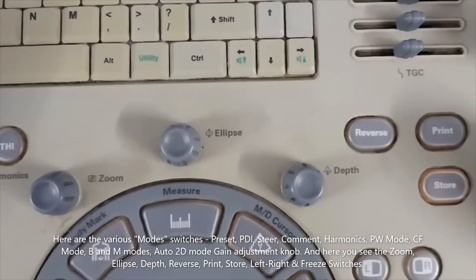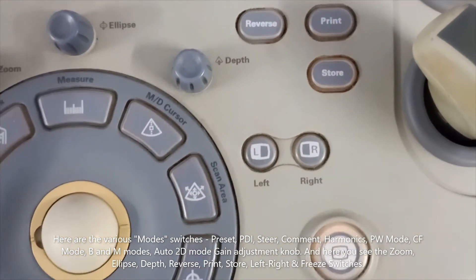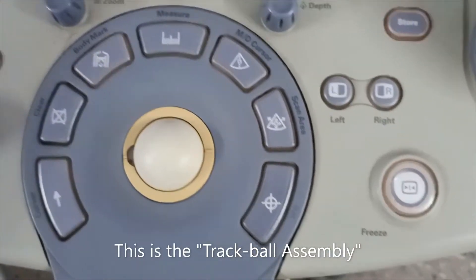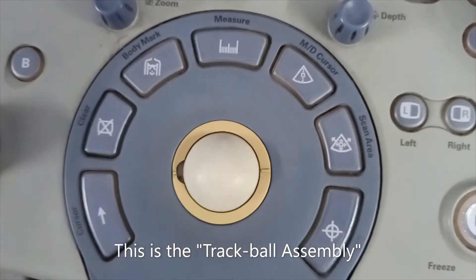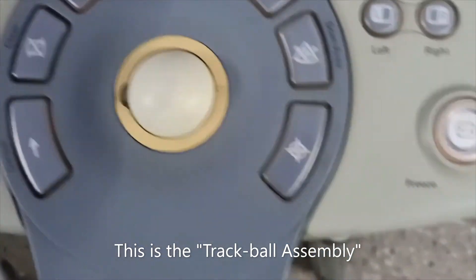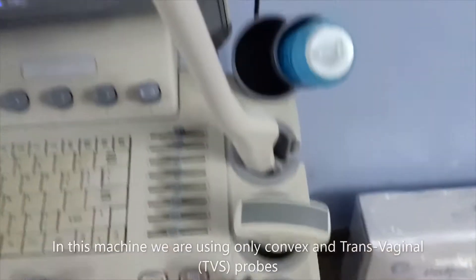Here you can see zoom, ellipse, depth, reverse, print, store, left, right, and freeze. This is the trackball assembly. In this trackball assembly you can see cursor, clear, body mark, measurement, MD cursor, scan area, and the select button.